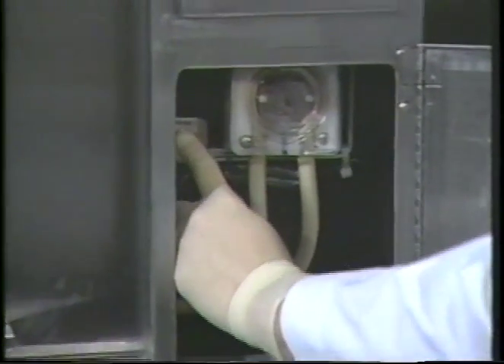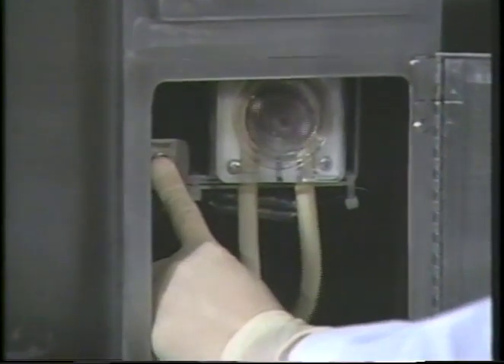An easier way to describe the function of detergents is to say they break down organic soils such as proteins in blood and/or suspend inorganic soils such as urine scale so proper contact and coverage can occur to enhance cleaning.